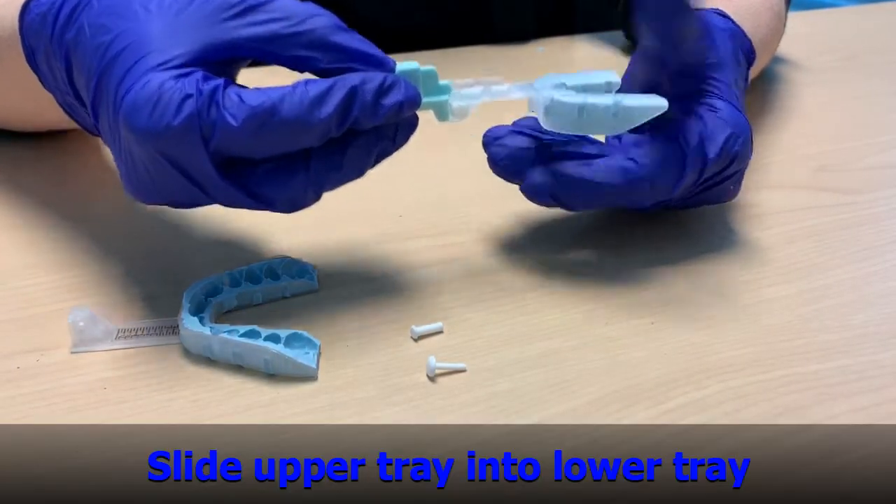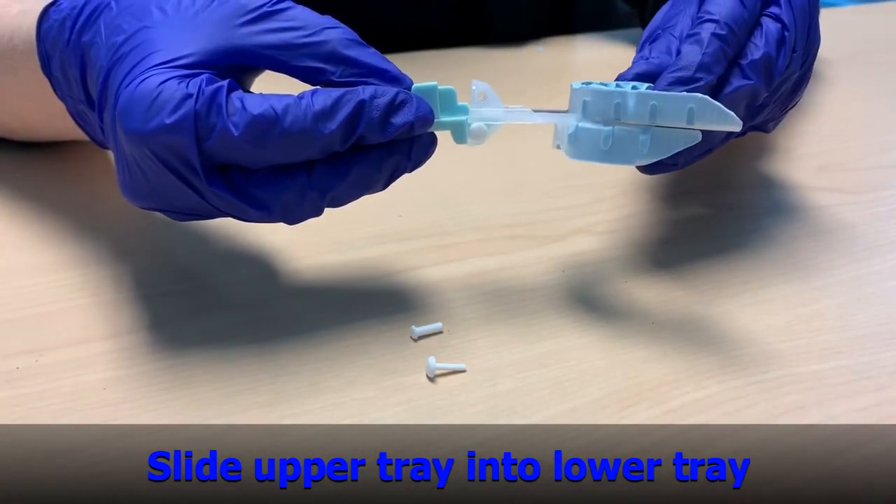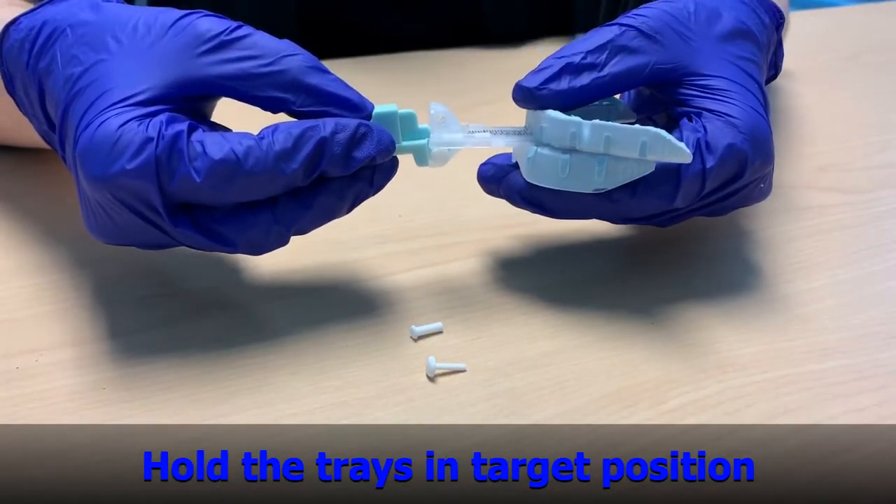Step 5. Now slide the upper tray into the rails of the lower tray. Hold the trays in target position.